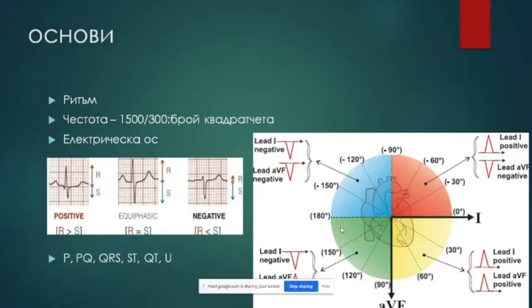All right. Can you speak louder? The heart rate. That's the second most important thing. The first thing is sinus, one of them. If it's in sinus rhythm or not? Yes, that's the most important thing to define. What's the rhythm of the heart?